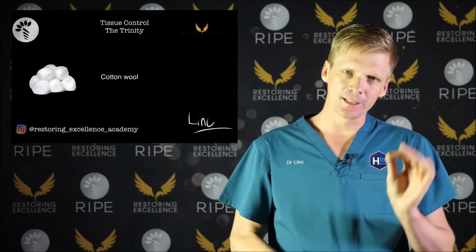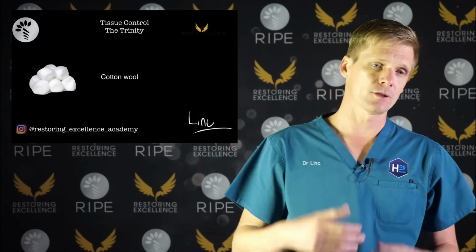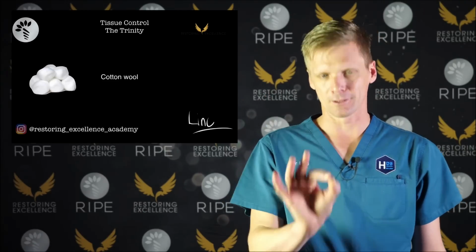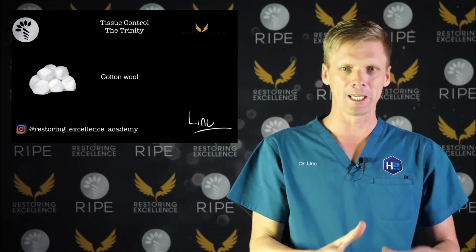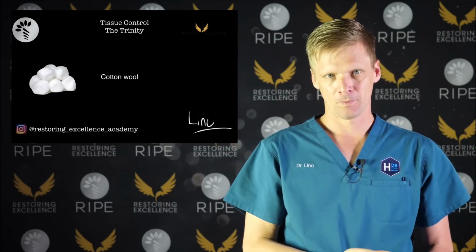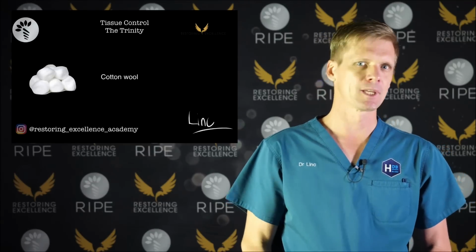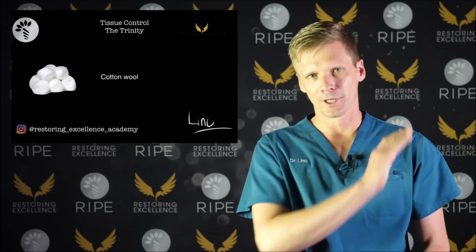Now, you need to remember, slow is fast. With retraction or with tissue control, the more you try and make the tissue stop bleeding, the more it bleeds. So you can't keep poking at it. You can't put the cord in and pull it out. You can't put cotton wool in and pull it out. You can't keep putting things in. You have to put it in and wait. Now, if it's bleeding a lot, you need to wait 10 minutes. If you try and do it sooner, you're just going to get stressed and you're going to take the impression 7 times, and the impression is going to be rubbish because it's going to have blood everywhere. So you put it in and you wait.